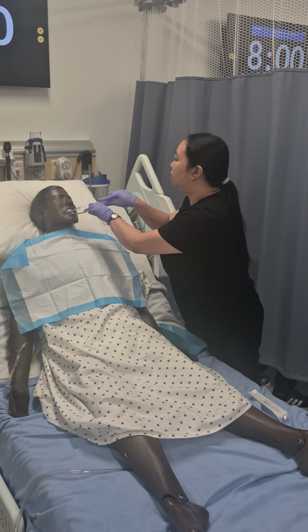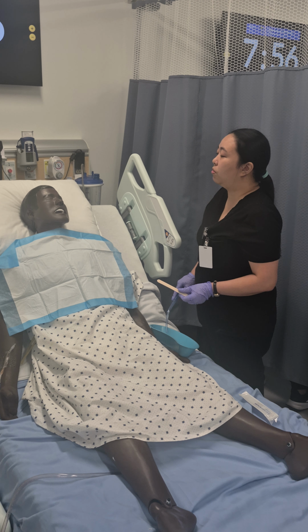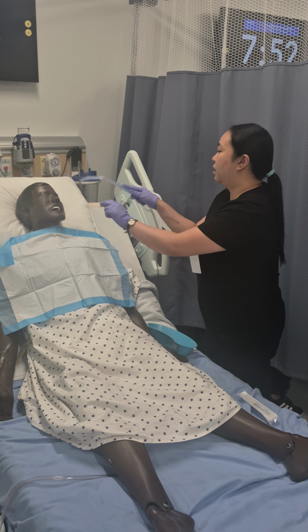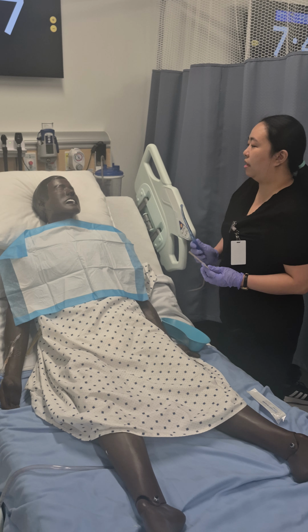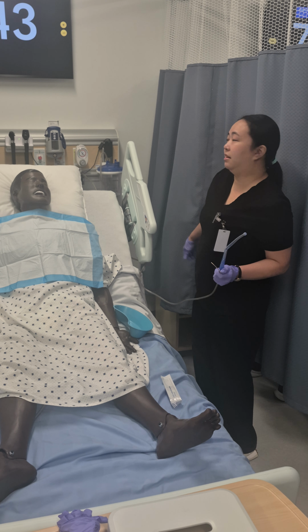Before the next round of suctioning, if you could cough or deep breathe first, then I'm going to do it again. And then if everything is clear already, I'm done with the oral suctioning, and then I'm going to proceed to the next skills.